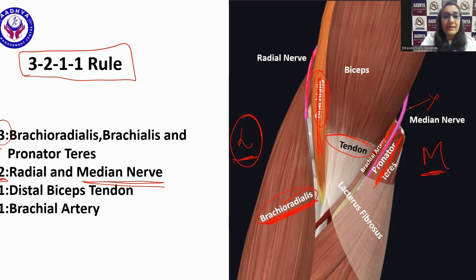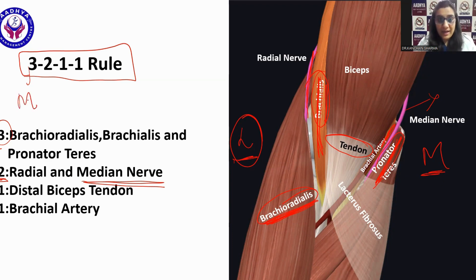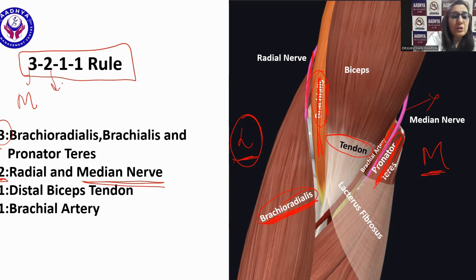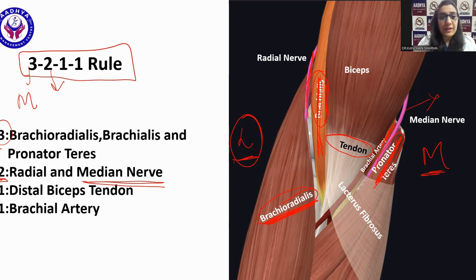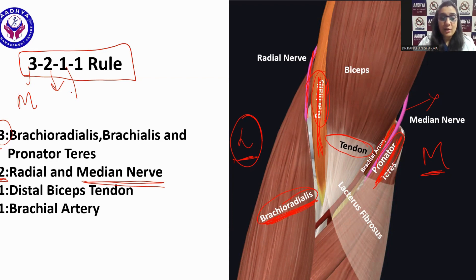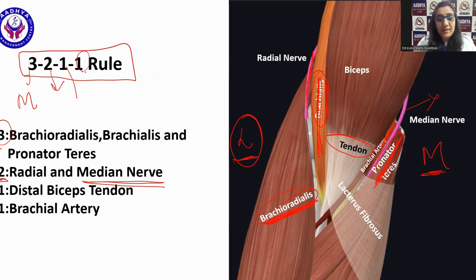To repeat the 3-2-1-1 rule: starting from the lateral side, 3 is for the 3 muscles — brachioradialis, brachialis, and pronator teres. The 2 is for 2 nerves — the radial nerve in the fascial plane between the brachioradialis and brachialis, and the median nerve between the brachialis and pronator teres. Then 1 tendon — the distal biceps tendon — and 1 artery — the brachial artery.